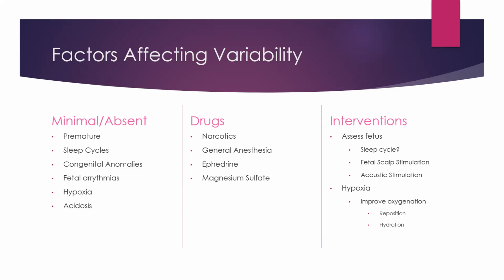And there's also acoustic stimulation, which is a little buzzer. It's a little vibrating buzzer that we place on the maternal abdomen that gives a vibration, and the baby can hear it intrauterine, and that can stimulate the baby to move.